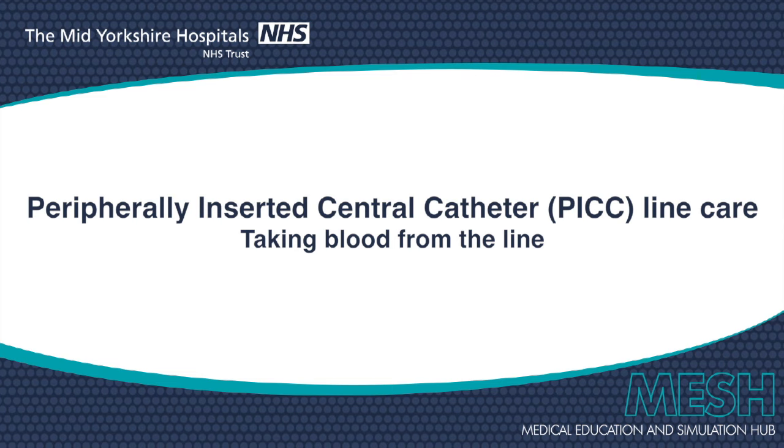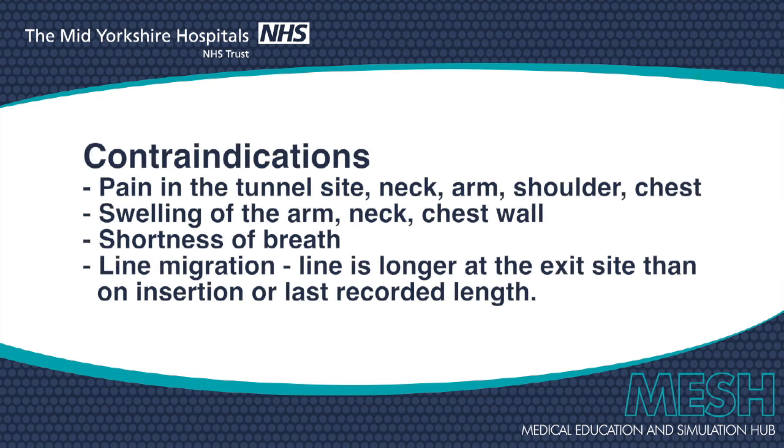The aim of this video is to show the practitioner how to take blood from a PICC line. The practitioner should make an assessment of the appropriateness of the intervention, the wellness of the patient, any potential contraindications showing on screen now, and the patient's nursing, medical, and line care pathway notes should be reviewed.